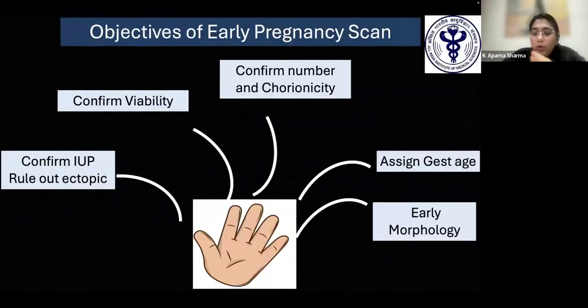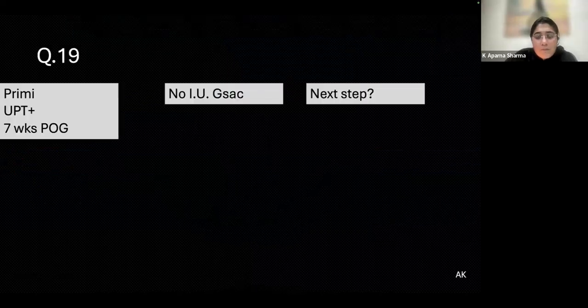Right. So this is very important, and that's why they say that gestational age measurement is extremely important and we should not assign it before 8 to 9 weeks of gestation because, as you said, the embryo is flexed. So measurement of these parameters is extremely important.